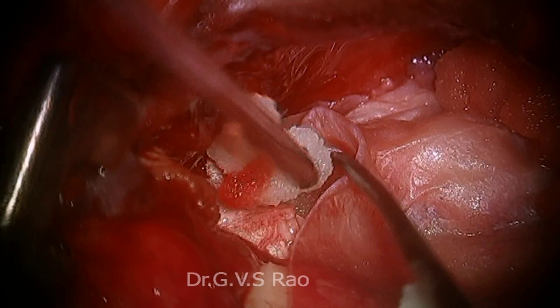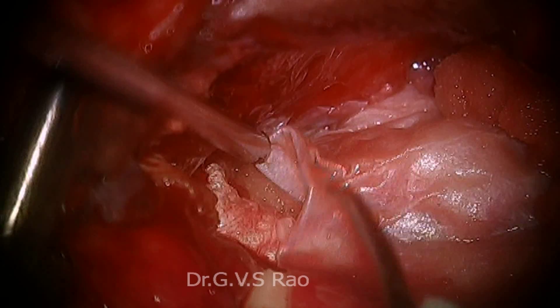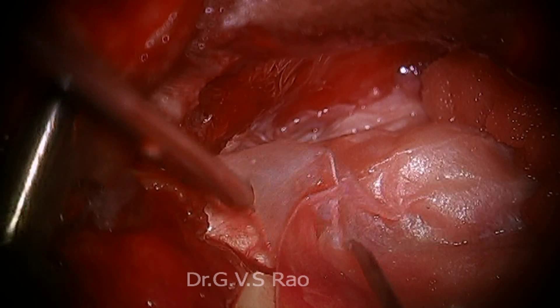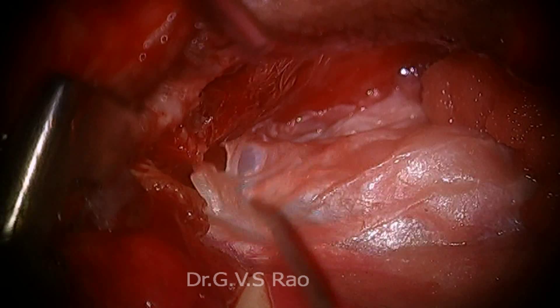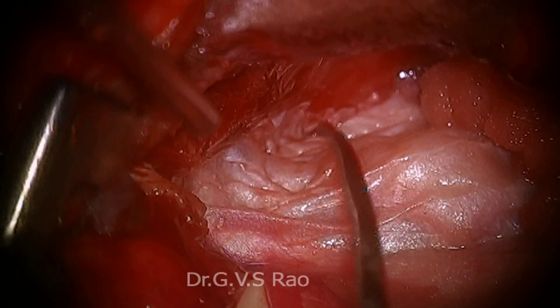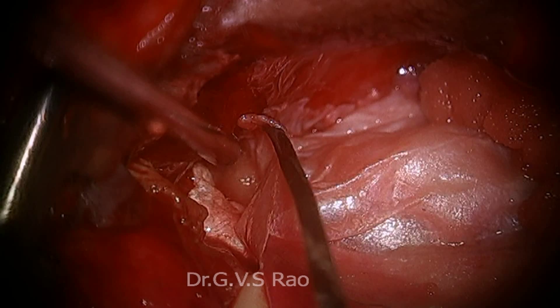You may think the facial nerve is nude here, even though the sheath is there — no protective covering. That protective covering — how it comes, I will show you. A little more focus is required. Now see — this is the fold of the temporalis fascia. See, all these things you have to keep in mind. See — a little air is there. You want to leave the air, you can leave it. You don't want to leave the air, you can suck out the air. Take out the air.